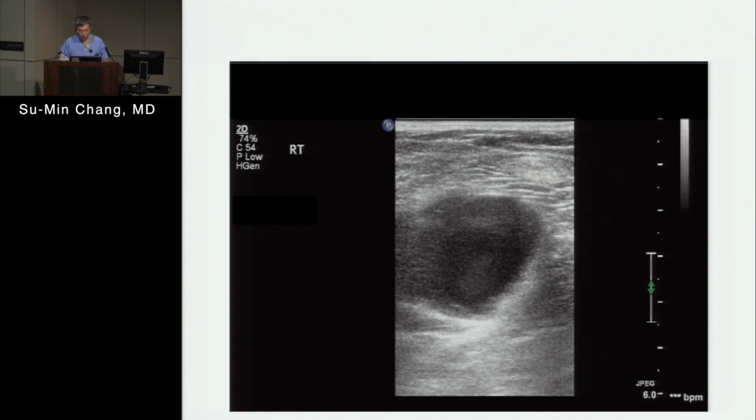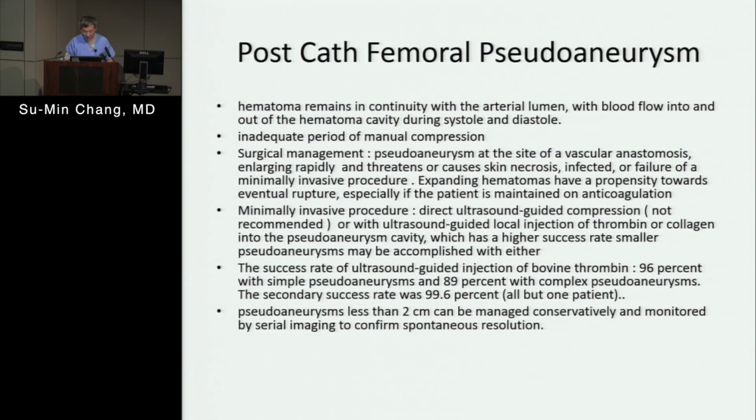So the idea was to show you the images, actually, all the sequence of injecting the thrombin, and eventually I think this was the final result: you can see the spontaneous contrast, thrombin from fibrin formation, and then eventually resolve. Okay, I think I can spend 2 minutes trying to locate the slides, because otherwise I don't think it's right.